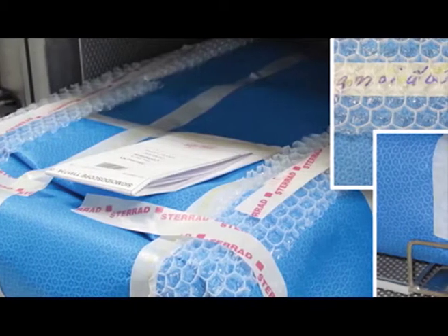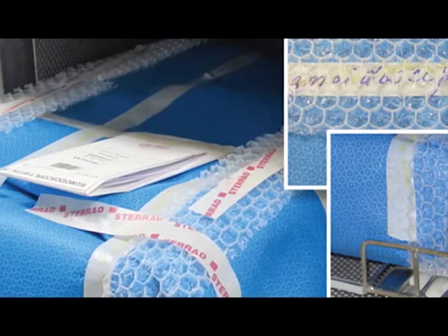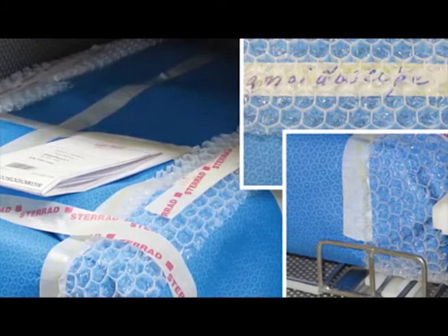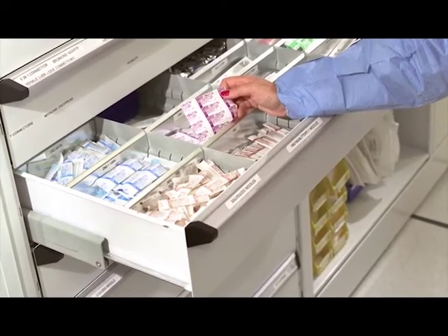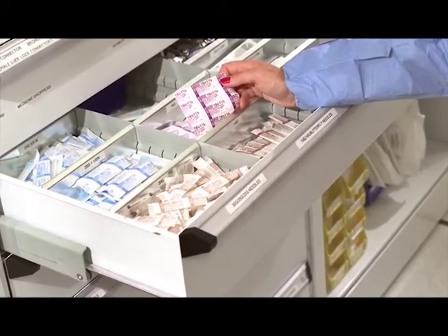The materials and techniques used for packaging must allow the sterilant to contact the device during the sterilization process as well as to protect the device from contamination during storage and handling before it is used. The time between sterilization and use may range from a few minutes to several weeks to many months also.